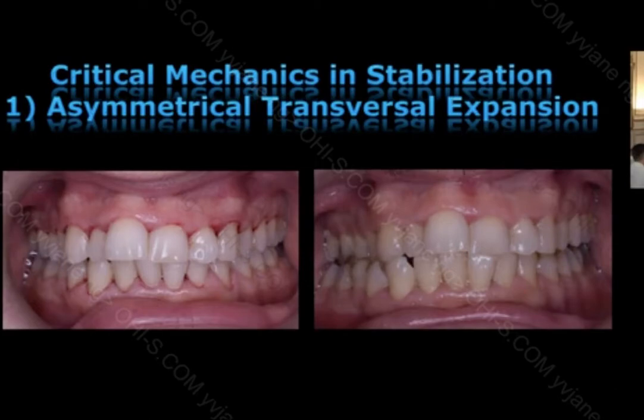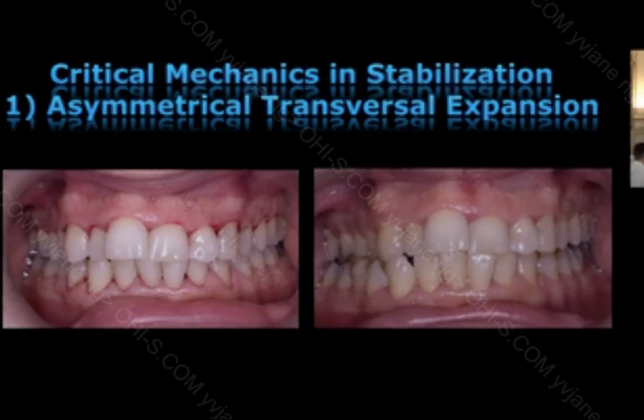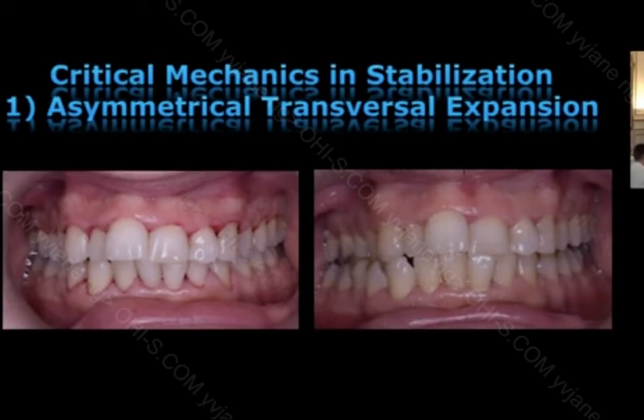If the patient is not consistently biting there, it will be broken. So if I place this material and it stays like that for 3 months, I know that there is no dual bite. He's always biting there, there, there, there.